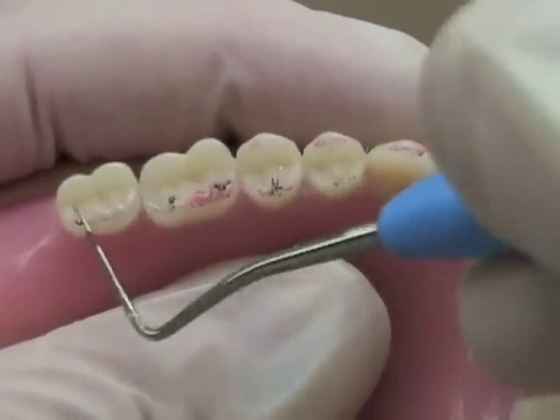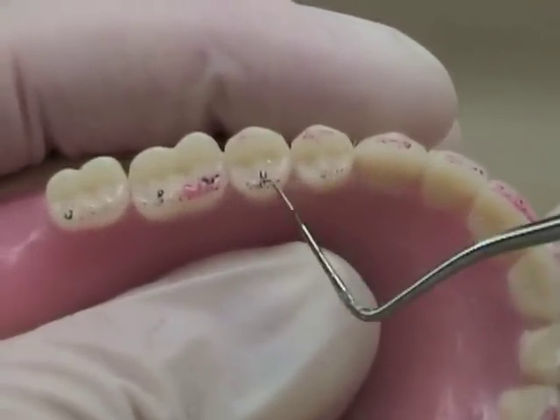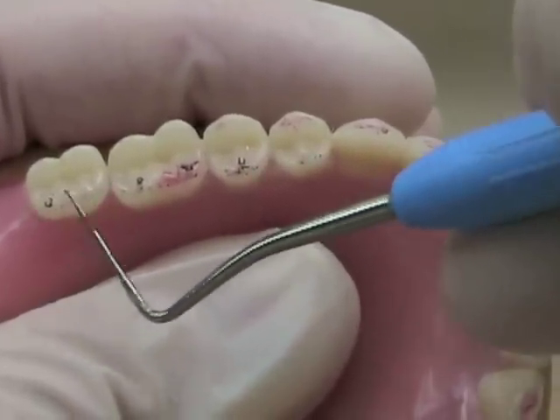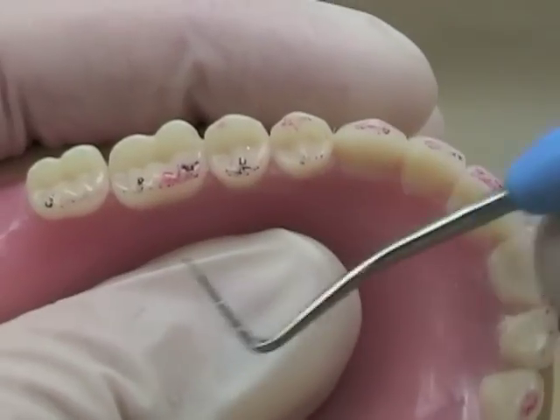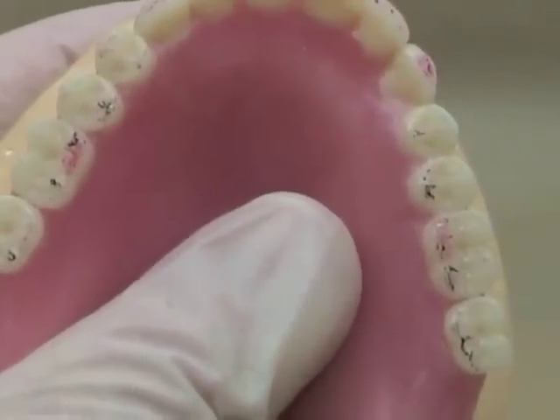First, you'd like to ensure that you have an even number of contacts on the teeth, so that no tooth is missing a contact. Second, how heavy the contacts are should be even for all the teeth on one side of the arch, and should also be even from side to side on the arch.